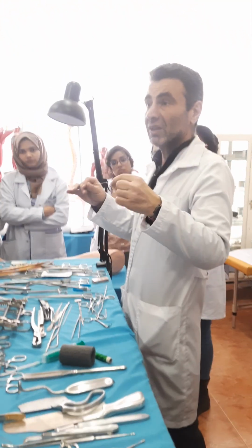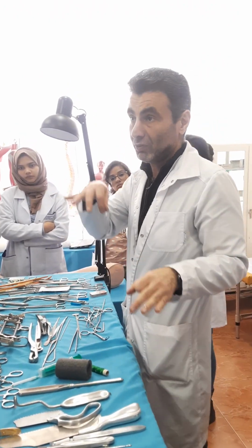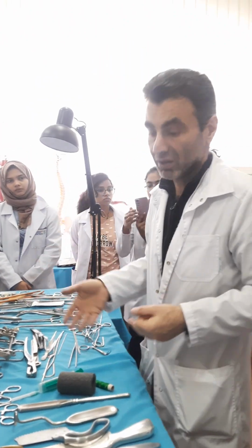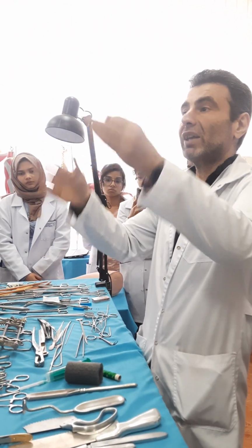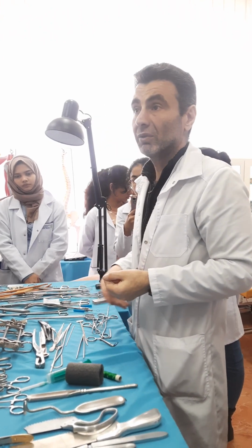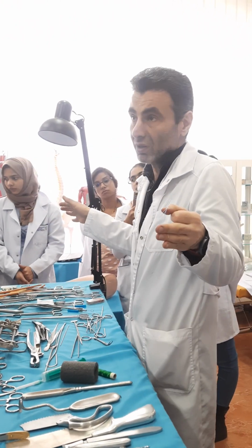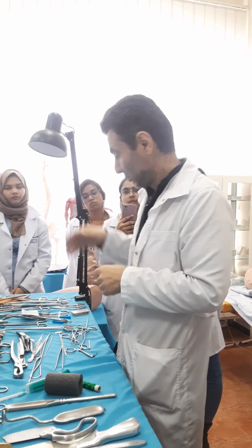There's a single thread, polyfilament. Second one, organic, non-organic. Non-organic are usually wires. Organic can be natural or synthetic. For example, this is the first synthetic. Natural, for example, silk, catgut, or something like that. And finally, absorbable, non-absorbable. It can be absorbed over time. By the way, the time of absorption can differ from 10 days minimum up to 1 year.